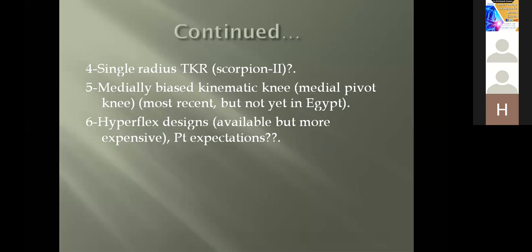Although it's most recent, it is not yet widely introduced in Egypt. Hyperflex designs are available, but more expensive, and you have to talk with your patient about his expectations. Hyperflexed designs are considered and designed to allow hyperflexion of the knee in exceptional situations, and not like many doctors and many companies that propagate their prosthesis as the prosthesis of squatting or sitting cross-legged or sitting in the prayer position.